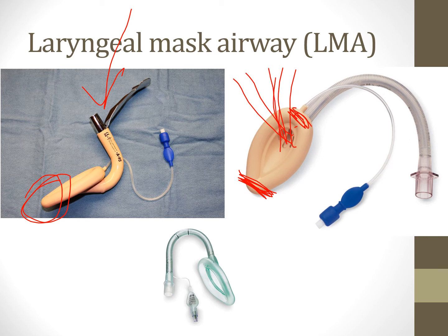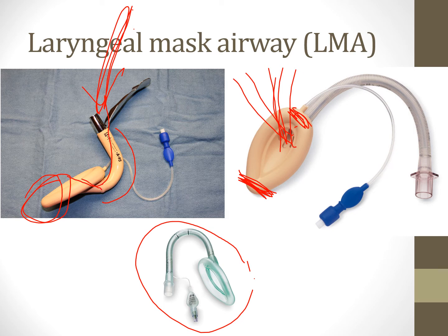These are very great, very useful. You can ventilate very well off of these if they're placed well. So this is all, once again, you using your technique, you're developing your skill with these. In fact, we've had to use these for difficult intubations. See how drastic this hook is here? For someone that has a very anterior airway, we can actually put this ET tube through here, and then a fast track LMA puts it anterior, and hopefully the ET tube will go through the trachea.